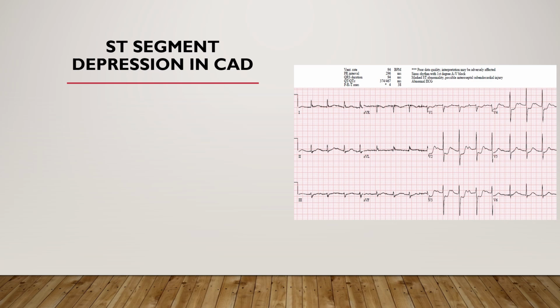And typically, non-STEMI patients are managed somewhat differently in most circumstances. However, it's important for us to remember that ST segment depression or new ST segment depression can actually represent a STEMI or ST segment elevation myocardial infarction, which is typically representation of acute thrombosis of a major coronary artery.